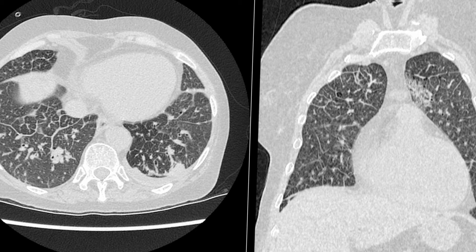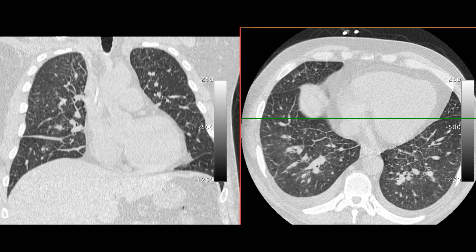Sometimes you can diagnose heart failure on a CT. This patient has a left pleural effusion with thickened interlobular septa, due to engorged fluid of pulmonary venous hypertension or heart failure. Here is another case — this patient has fluid in the horizontal fissure, bilateral pleural effusions, and interlobular septal thickening, which is due to fluid in the interlobular septum caused by pulmonary venous hypertension. This patient has heart failure.